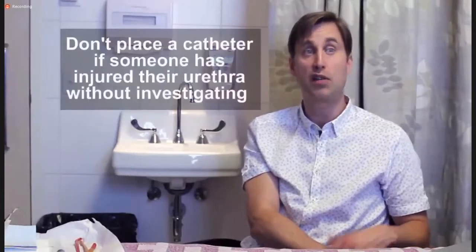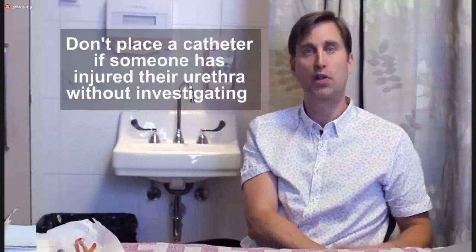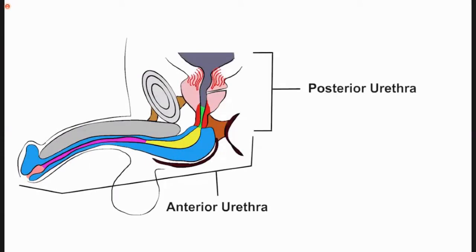There are some cases where you wouldn't want to put a catheter in someone's urethra, and that would be the unique circumstance where someone sustained a pelvic fracture and has injured their urethra. In those cases, you want to do a urethrogram and assess the status of the urethra before putting a urinary catheter. In basic terms, the urethra has 4 parts, and these are divided into the anterior urethra and the posterior urethra.